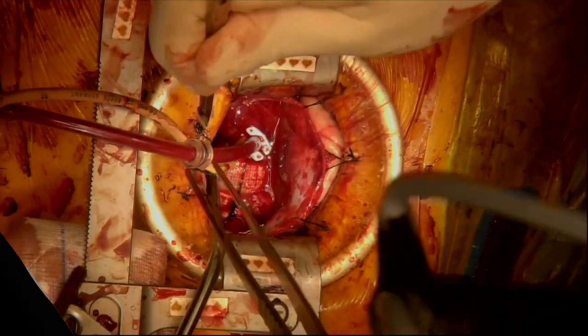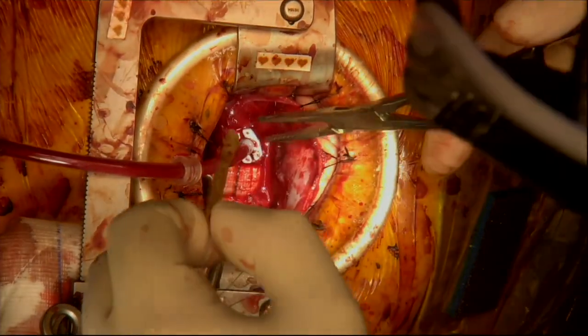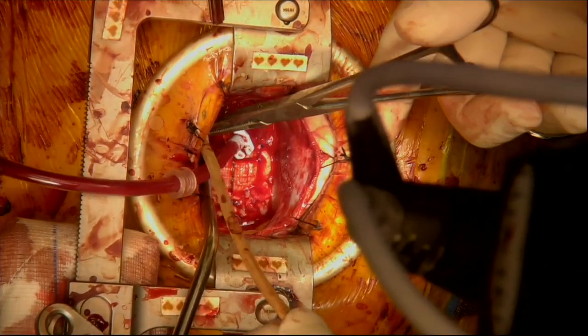Once the de-airing is complete, the root cannula can be removed. Maintaining gentle pressure on the purse string snare, the cannula is withdrawn.